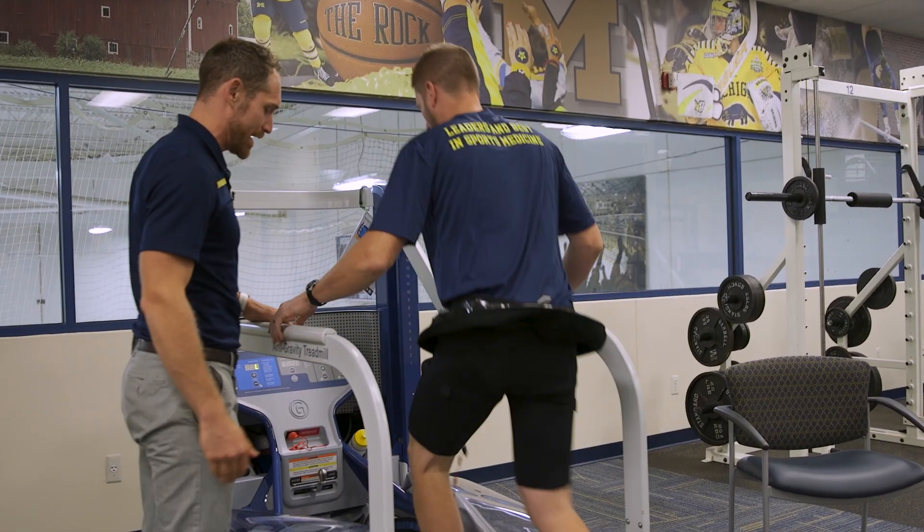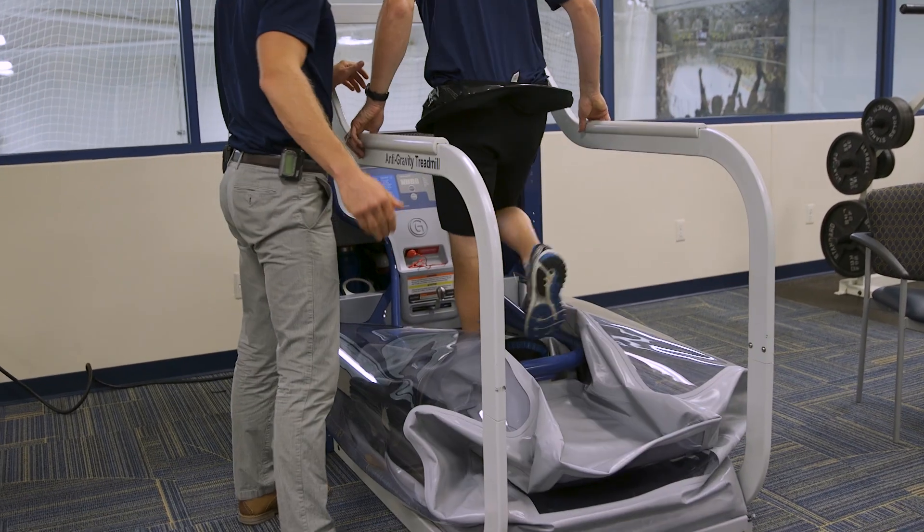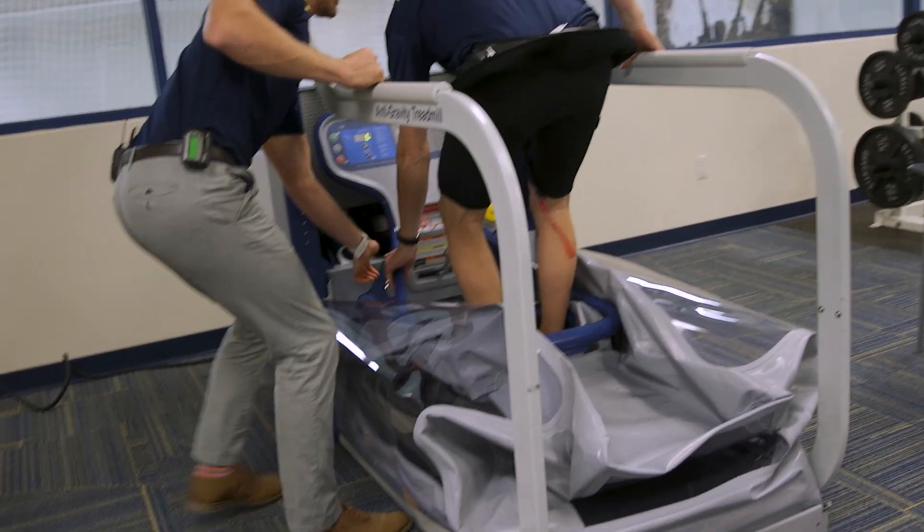They can step right on the back there, go ahead Matt, and then step into the cockpit, and then they can reach down and pick it up through the blue pipes there.